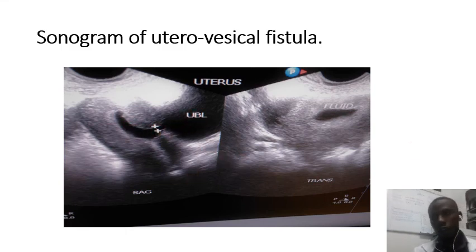Alright, so after getting this, hopefully you will not again miss it on ultrasound. We all know that among the predisposing factors, we always have things like previous scar, these mothers who are operated. So it can gap up and finally form this fistula. There are other various predisposing factors. That one you can read and find out.